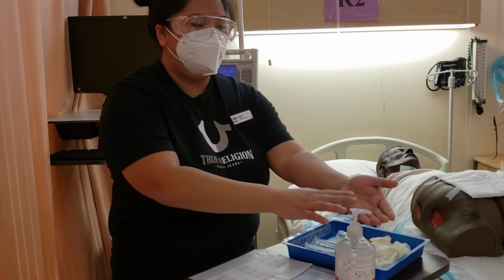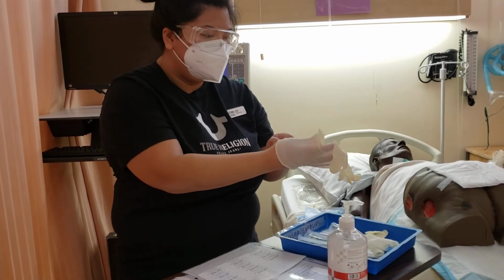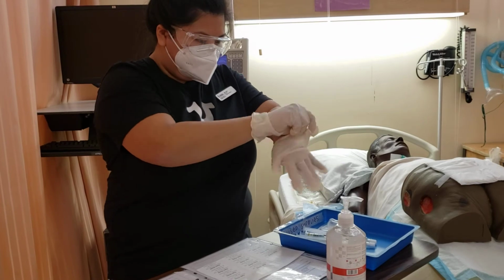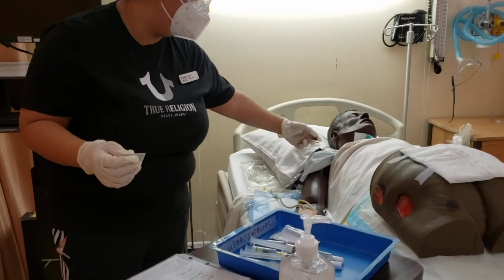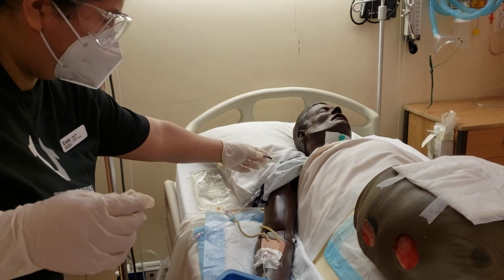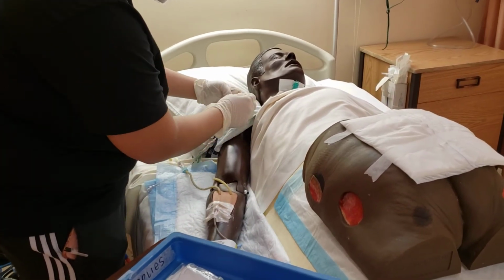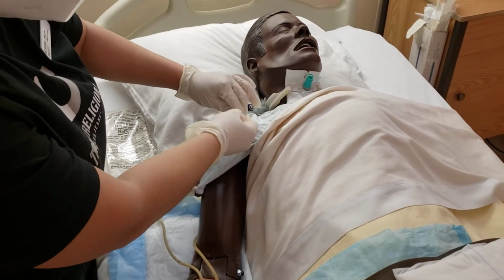And then I'll do hand hygiene. Let's pretend that the 5 minutes have passed. I would put on my clean gloves. And using an alcohol swab, we are going to use the brown lumen because the brown lumen is often the largest. So I would use the brown lumen to obtain my blood samples. I will swab it for 30 seconds and let it dry for 15 seconds.